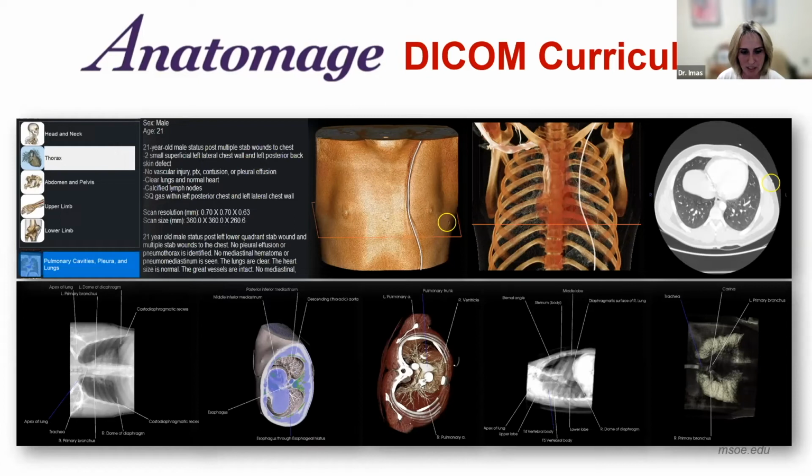In this particular case, in addition to a CT image, this case also had AP view X-ray, as well as a lateral X-ray of the patient. And so you can look, this lower left figure shows the AP view X-ray, and you see the anatomical labelings. So similarly, you got here another black and white image is the lateral X-ray as well, labeled appropriately. So very useful.